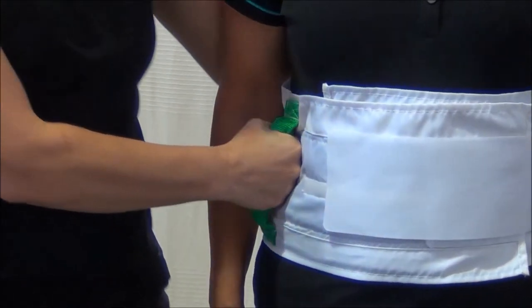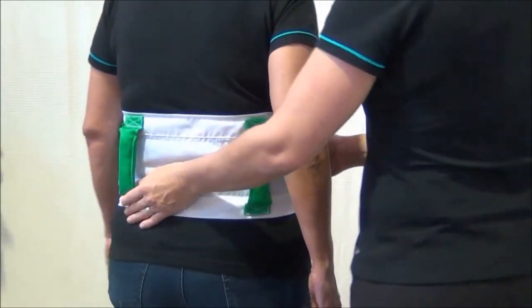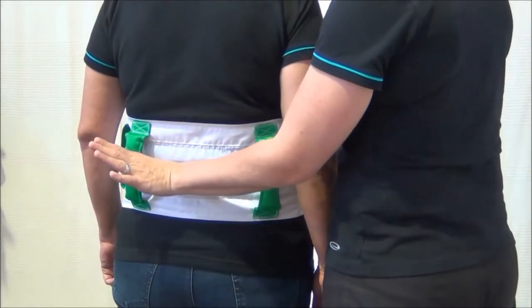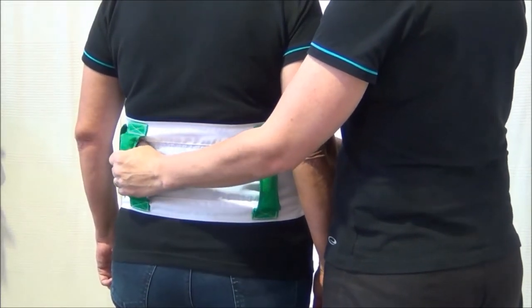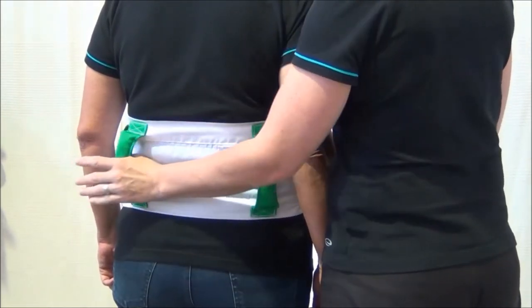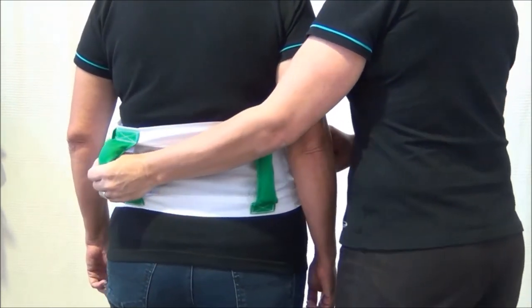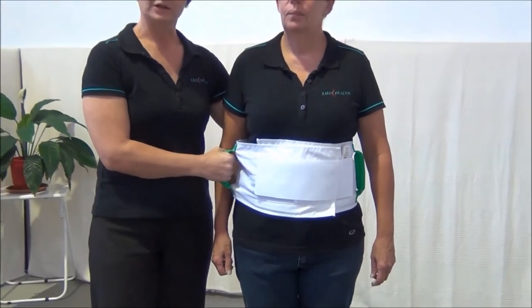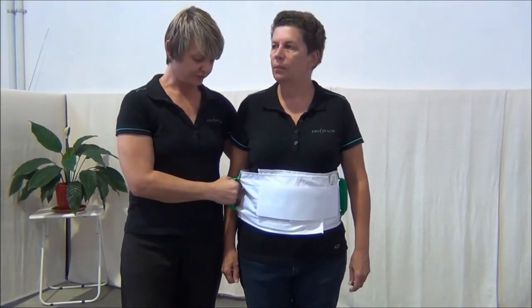On the rear handle, you place your hand across the client with your thumb under the handle, again making a fist. This hand has gentle pressure away. By pushing away at the back and pulling towards you at the front, you form a very secure and stable surface.